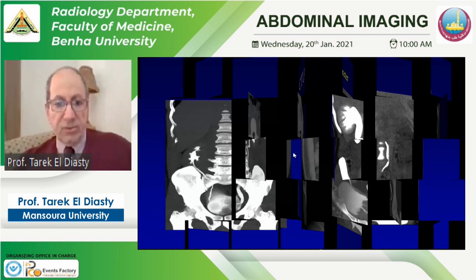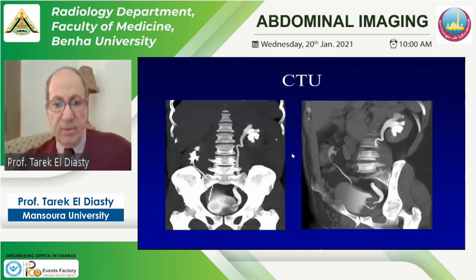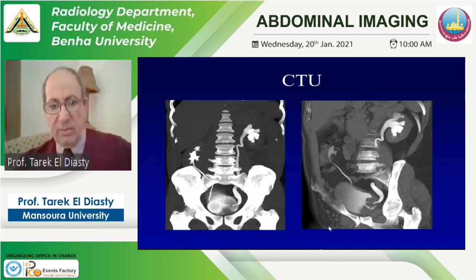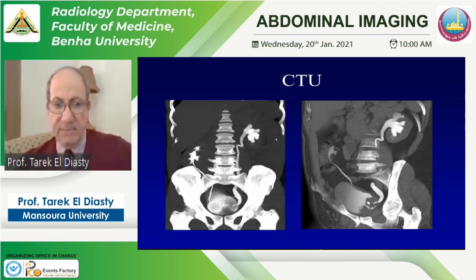This is also an example of a bladder tumor on CT urography with a non-functioning kidney. There is a typical filling defect in a patient with hematuria, denoting a bladder mass.